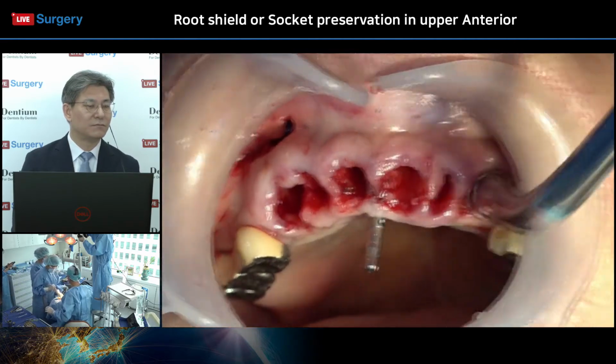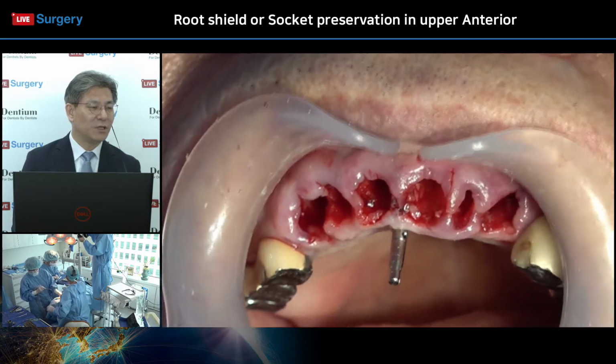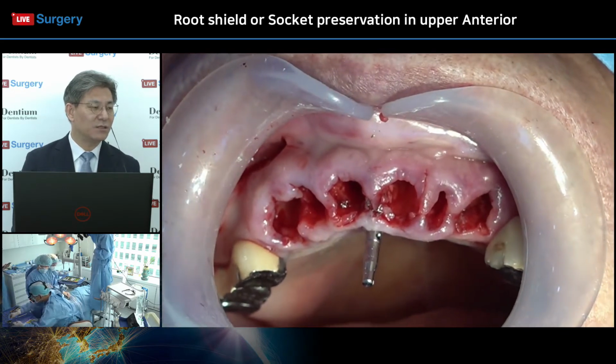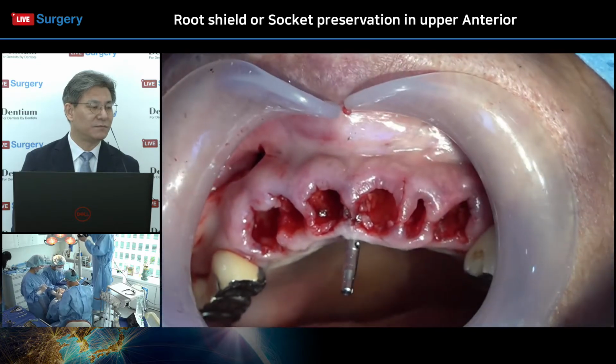본 그래프팅 first, the central incisor. About the central incisor area, bone grafting first and implant insertion. Yes. 고마워요.